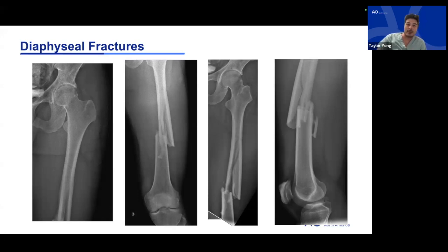I don't know. What do you guys do at Utah, Lucas? You guys in the MRI crew? We're still doing the fine cut CT scans. That work that came out of Houston and Dr. Kellum's group's very interesting, but I don't think super practical at many institutions, ours being one of them. So we're still getting fine cut CTs, and I think we're doing a good job. In my 5 years here, we haven't had a missed femoral neck associated with the femoral shaft, so that algorithm does seem to be working for us.